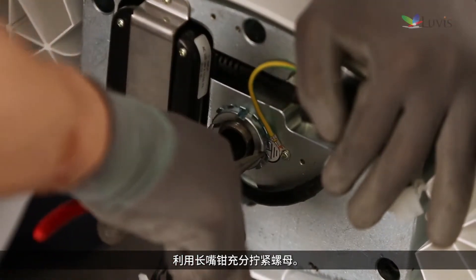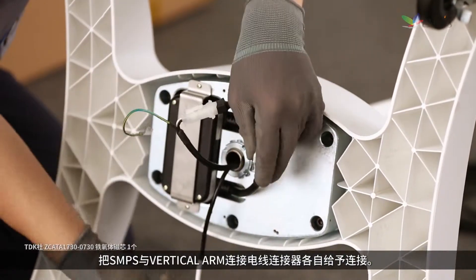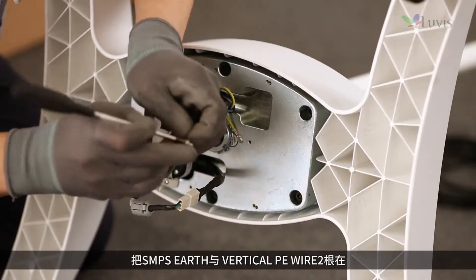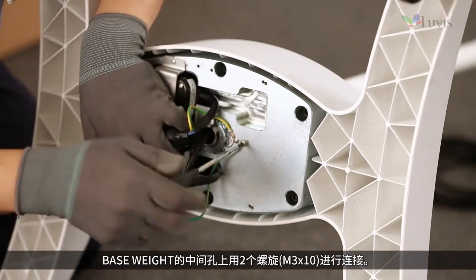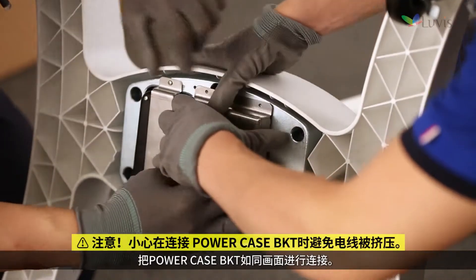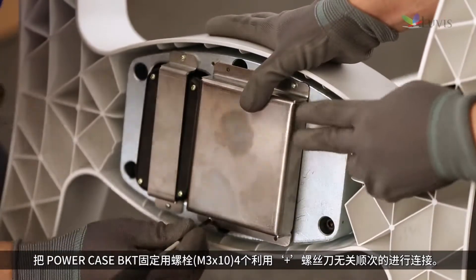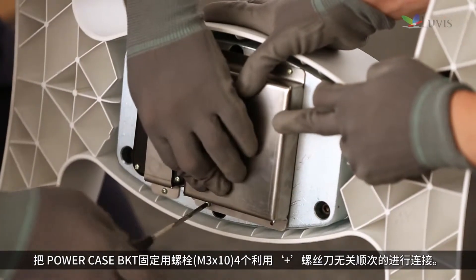Connect the SMPS to the connection wire connector of the vertical arm. Connect the SMPS earth and two strands of the vertical PE wire to the center hole of the base weight with two screws. Tighten the power case BKT as shown on screen and tighten four screws to fix it using a plus driver, regardless of sequence.